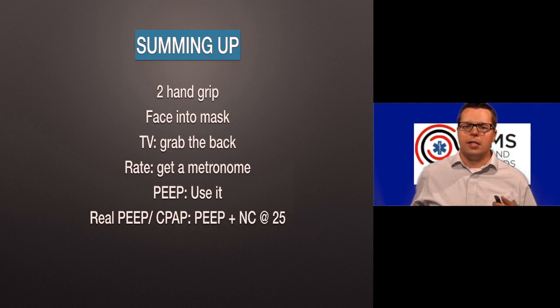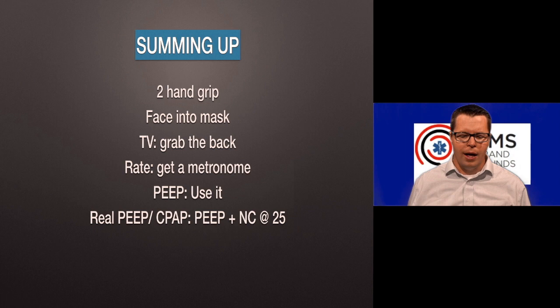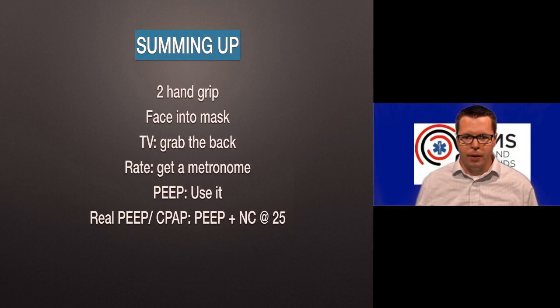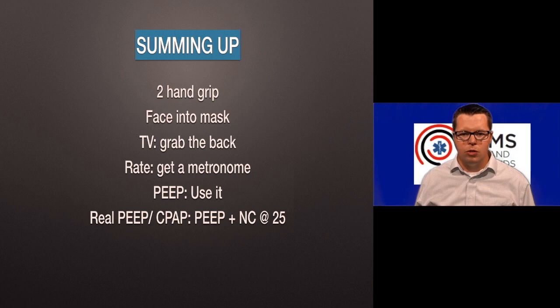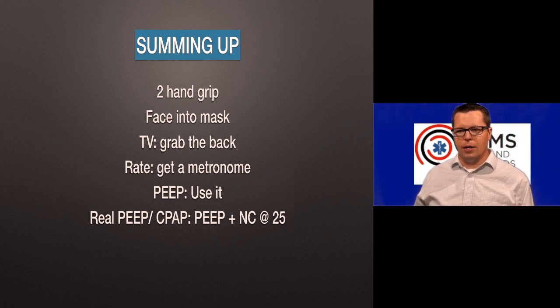So that's a way to use the bag, or a couple of ways to use the bag, if you don't have a ventilator available to you. Again, not an excuse to not use a ventilator, because a ventilator is generally better, but if you don't have one handy, or you don't have it available, or you can't figure out how to use it, then you should at least have excellent bagging technique using one of these guys.